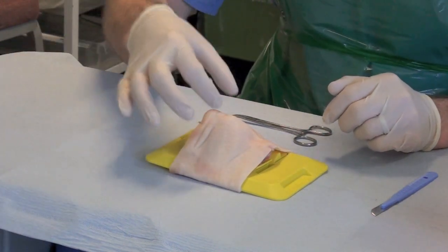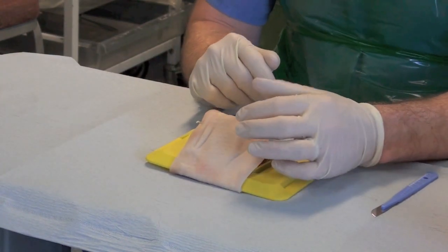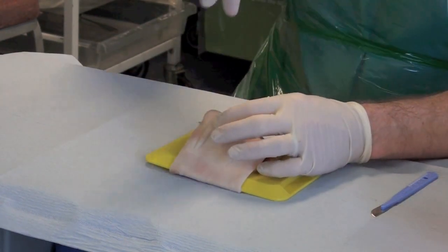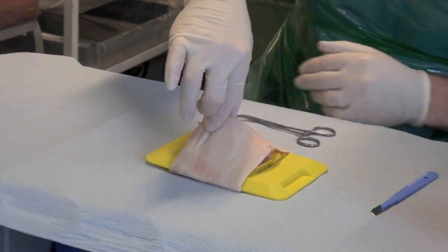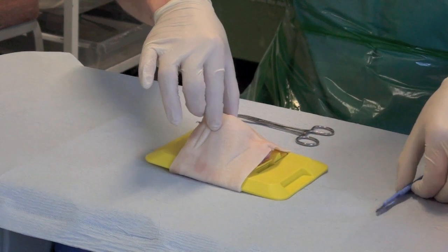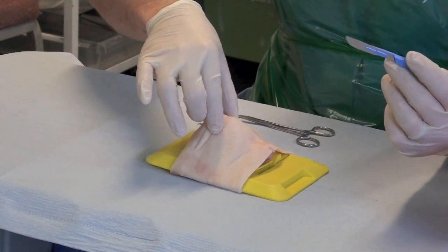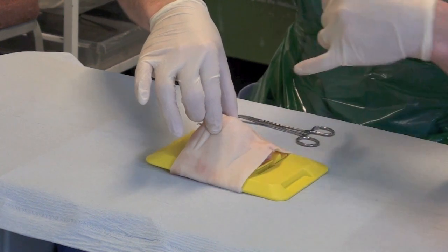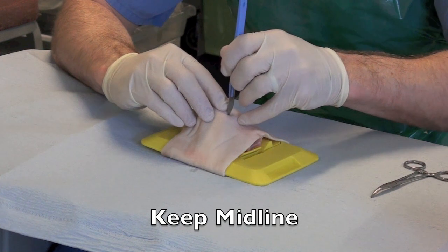Of course the patient's head is going to be here in real life, so perhaps we also just practice avoiding putting the hands here — keep your hands up here to avoid the patient's head. Stabilise the skin, you're going to take your blade. I'm left-handed, so if you're right-handed you can just reverse the whole process. I'm actually going to go in down here as well.